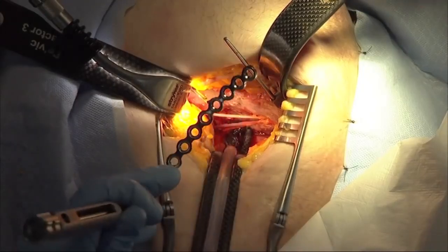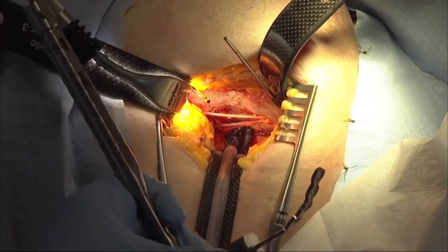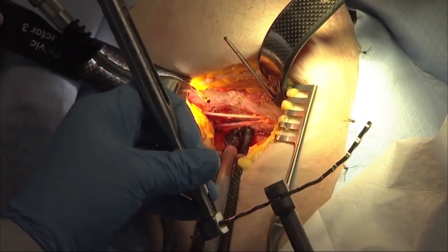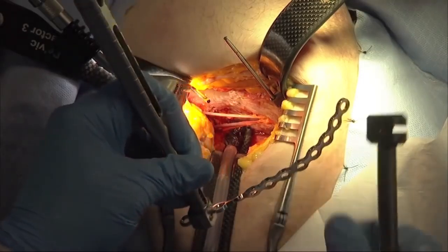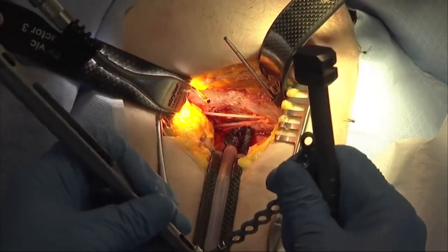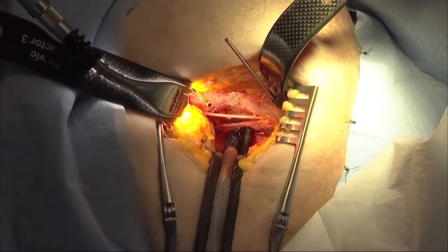And this new bending iron that has the ball to stabilize into the plate, that prevents you from dropping it on the floor, is a significant improvement to this system because the plate is held firmly in the one bending iron so that it doesn't get dropped.